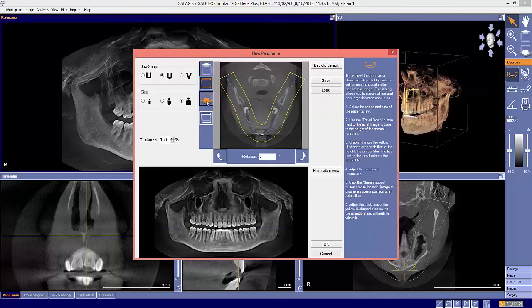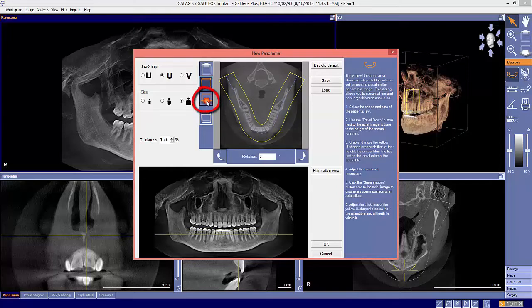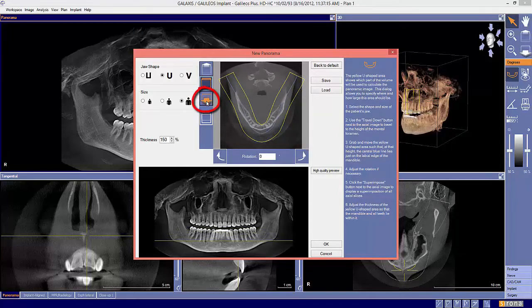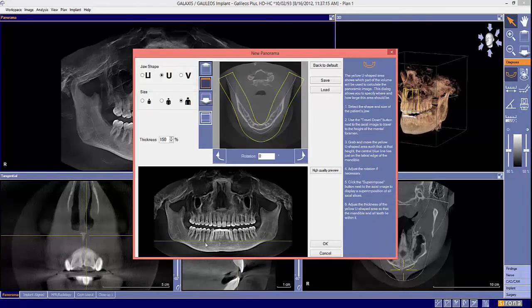You can do this by using this down arrow. You can click through it slowly or hold it down and let go once it intersects. It'll intersect here and also intersect in the axial view.